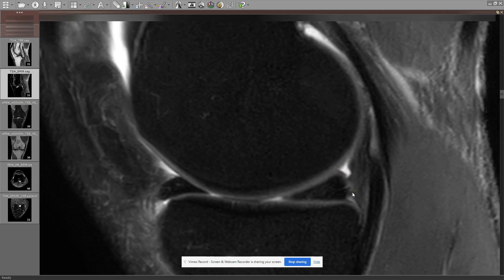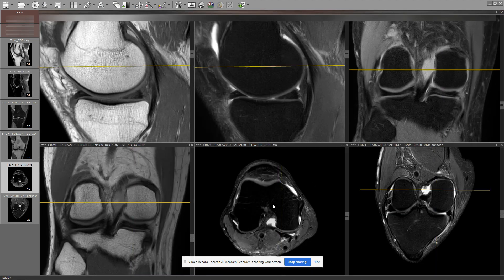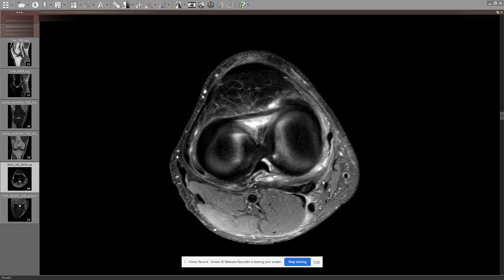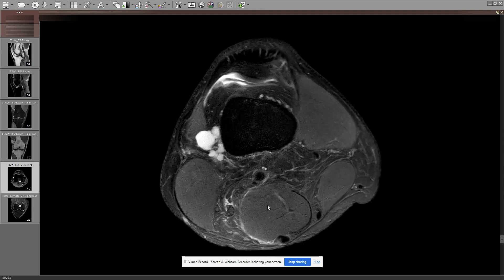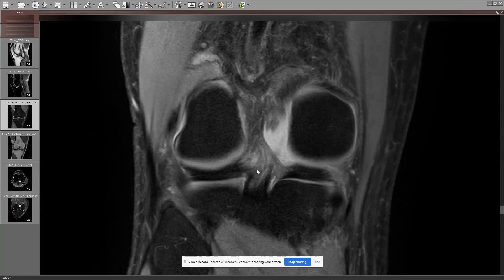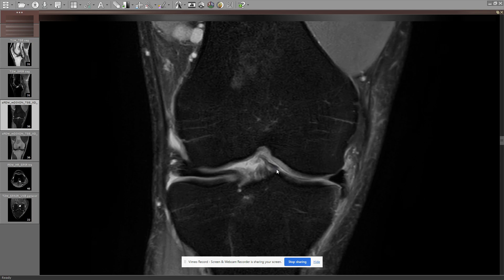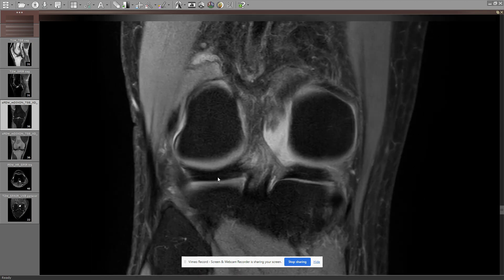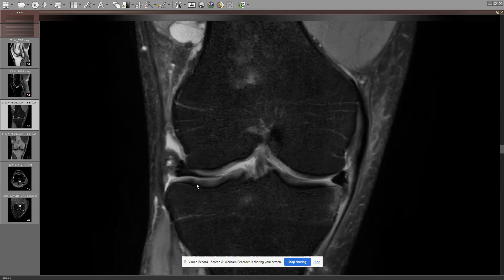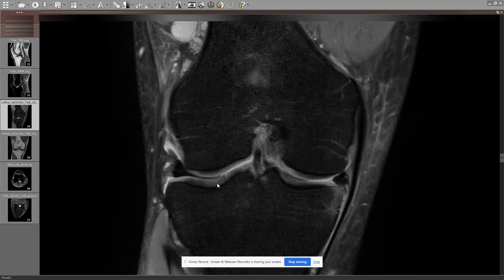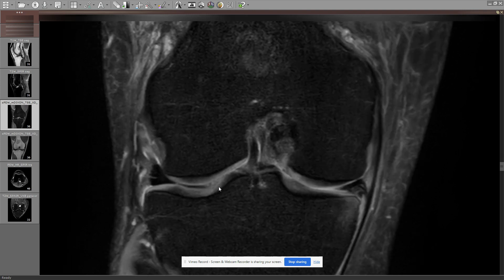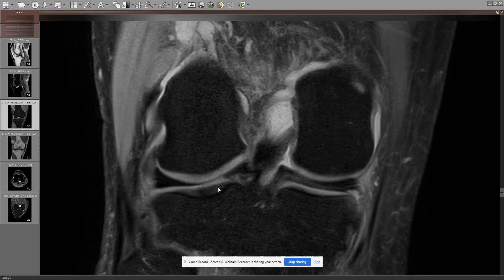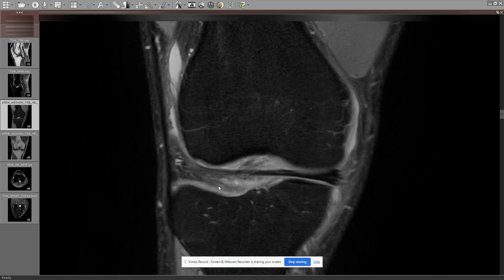So then we check the Baker's cyst — it's fine. The extensor tendons are fine. There's a bit more Baker's cyst, but it doesn't matter much. On the lateral side, we can see part of this oblique meniscomeniscal ligament crossing through the joint. Then we see the lateral meniscus; there's no obvious tear. Cartilage is okay. We could argue whether there's some tiny fraying changes, but that's not relevant, and no bone marrow edema.